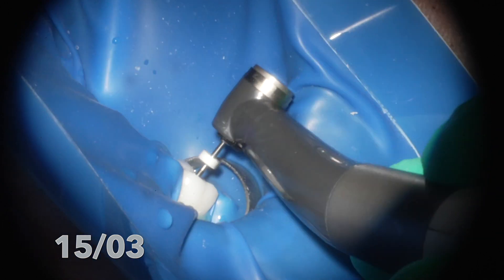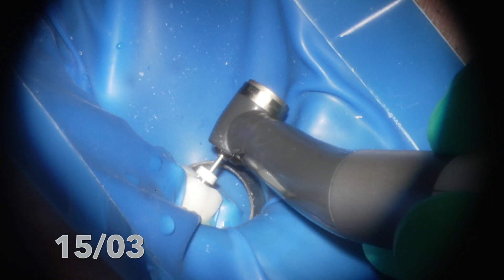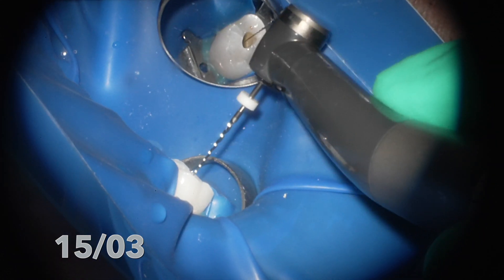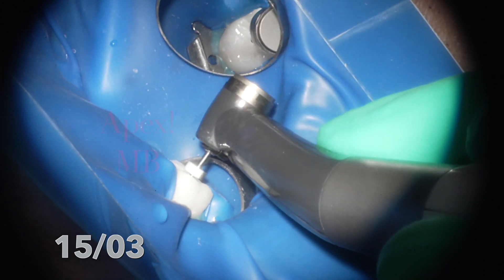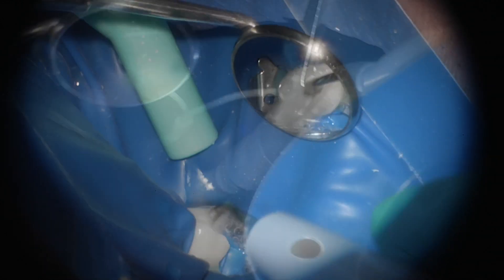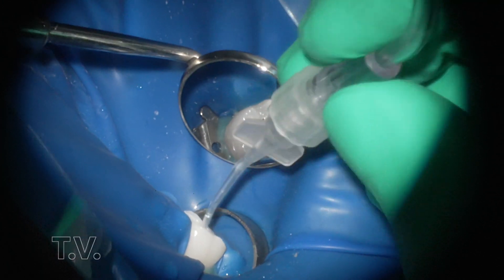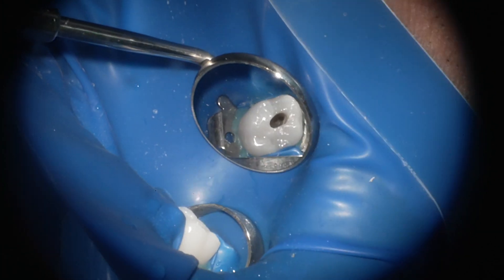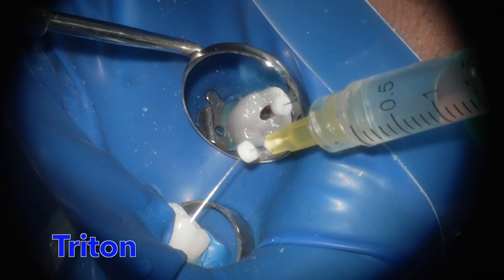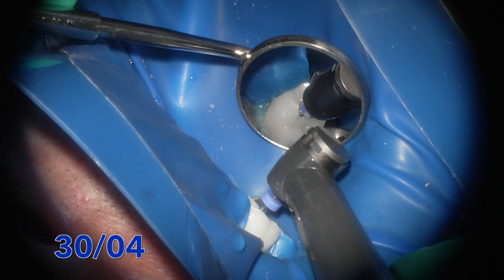On the distobuccal we have 20.5 mm, a little bit shorter than the palatal. Now doing the mesiobuccal — very light, gentle engagement motions without pushing. The moment you feel resistance, that's when to stop and use a hand file. Some people prefer to start with a hand file, but I find there are more problems with hand files. If you learn to use these files properly — with proper engagement time and without pushing — they work well. The scout reaches full working length on MB1, and we do the same for MB2.